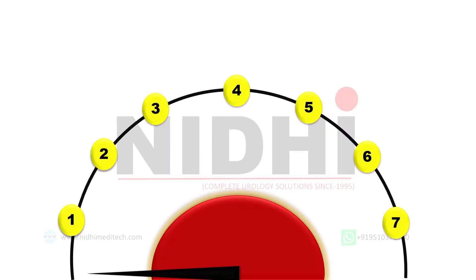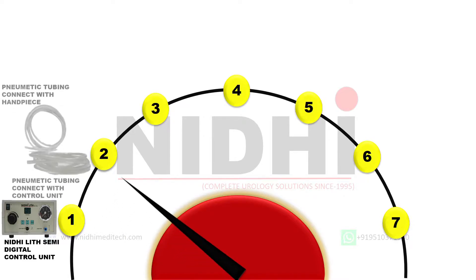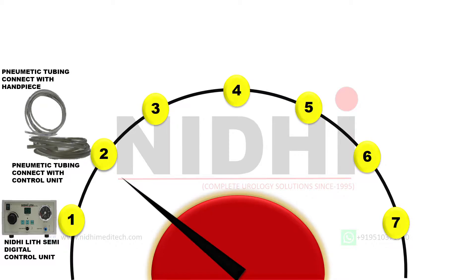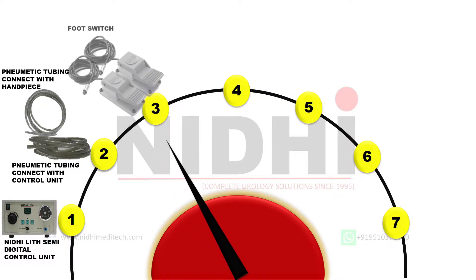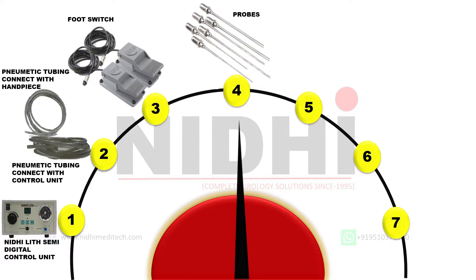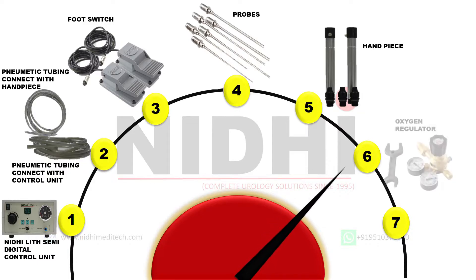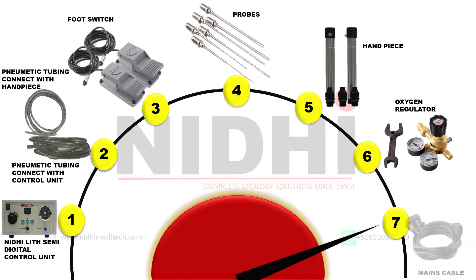Let's take a brief look at what instruments we are getting in the Nidilit Semi-Digital kit. First of all, we are getting the Nidilit Semi-Digital control unit. Along with it we have two types of tubing, and we will guide you how to use them in the next step. We also have two foot switches, but we need only one at a time to operate Nidilit Semi-Digital effectively. We have six probes of different sizes. We have received two hand pieces — again we need only one at a time, and the other one is a spare tool.